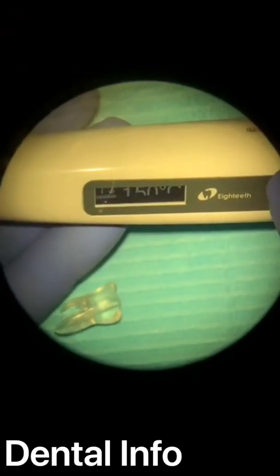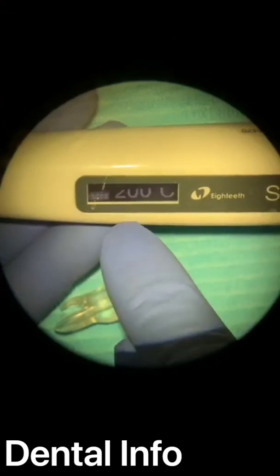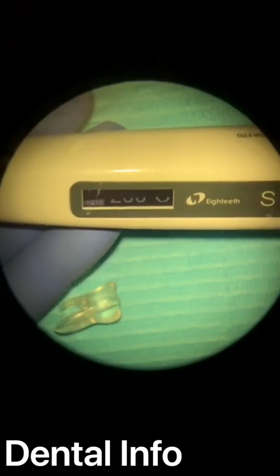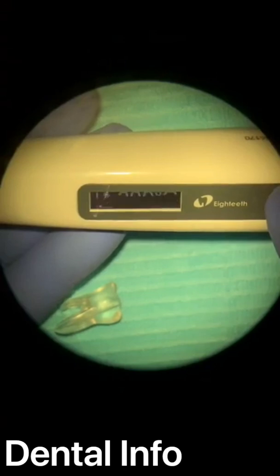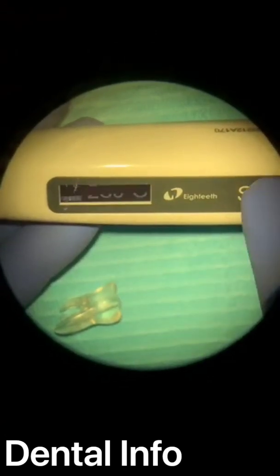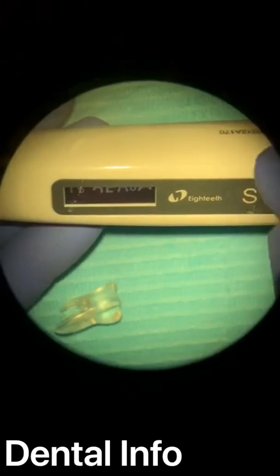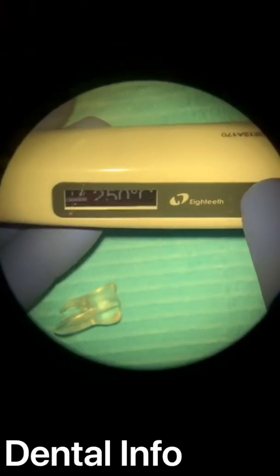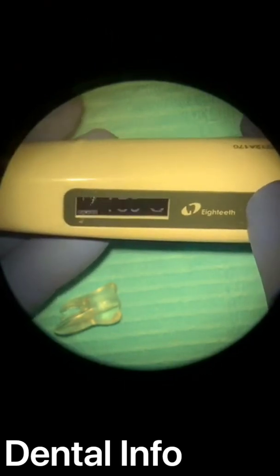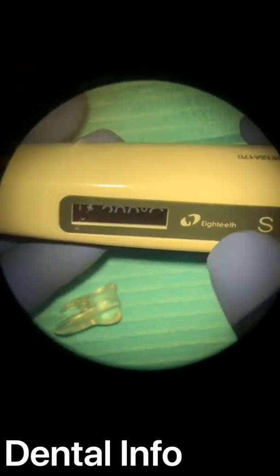I like to put it on the 200 degrees because I want to make the cut quickly and with less time. And you can go up to 250. I do not recommend 250 because it's too high. Okay, so I will put it on 200.